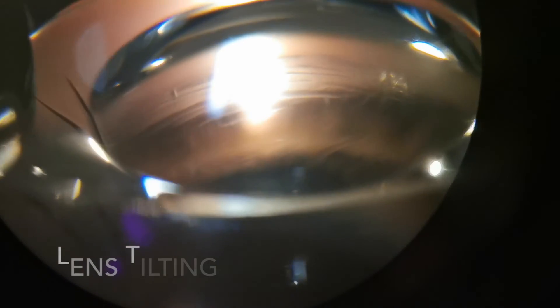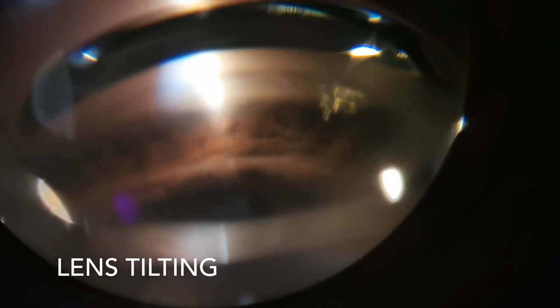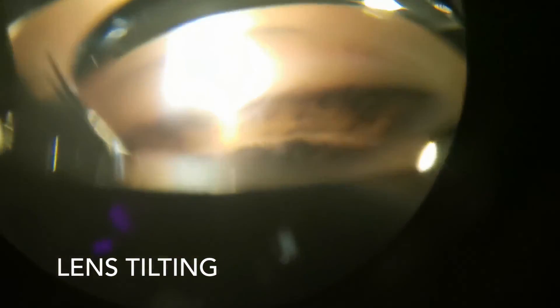Lens tilting is a really useful way to get a different view of the quadrant you're examining. Let's say you encounter an angle that is obscured by a really steep mid-peripheral iris. Tilting the lens in the direction of the angle you want to view, or having the patient look slightly in the direction of the observation mirror, will allow the light rays to pass over the obstructing iris and onto the angle, allowing a view. Here I'm tilting the lens quite dramatically to show you the different views you can achieve.